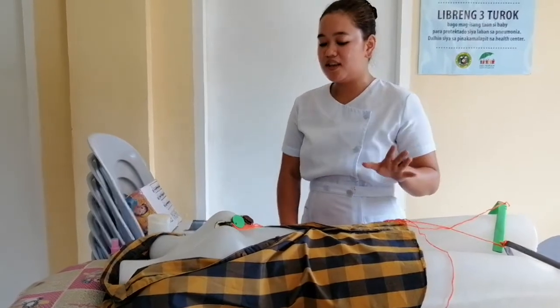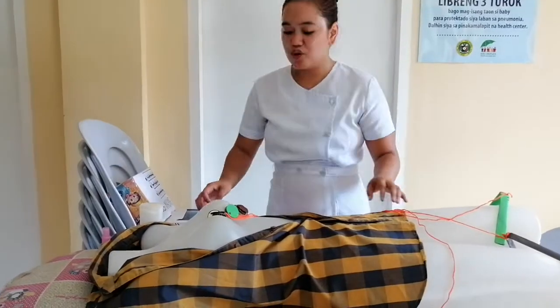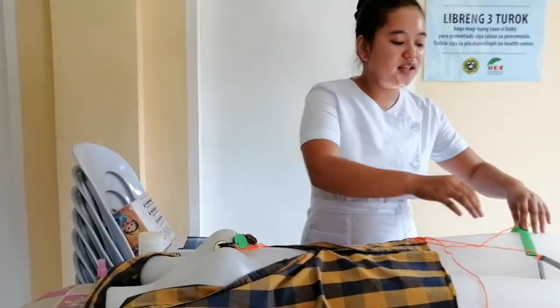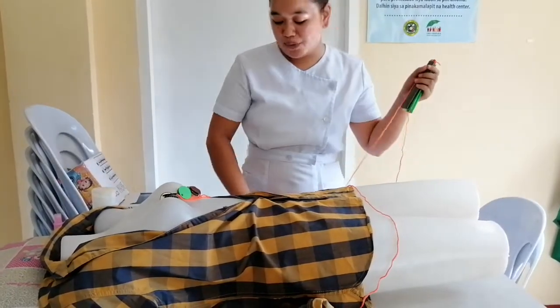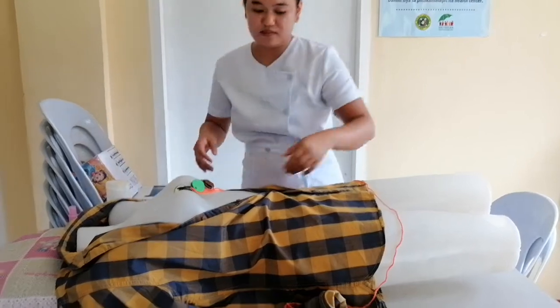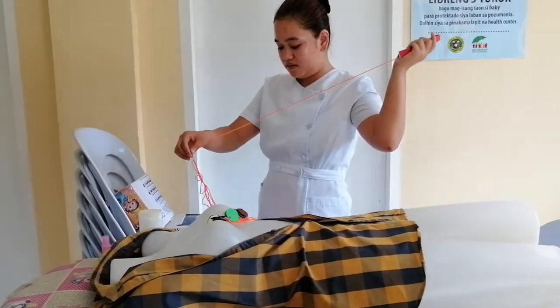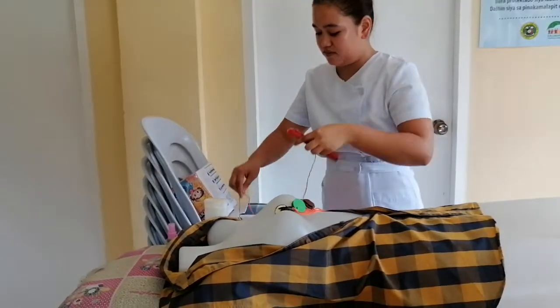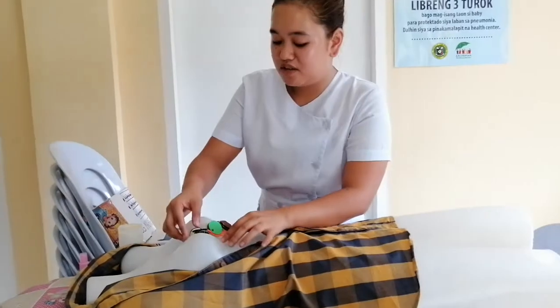So assume that the procedures are already done, and you are now going to remove all the leads you have placed on the upper and lower extremities. Then remove.